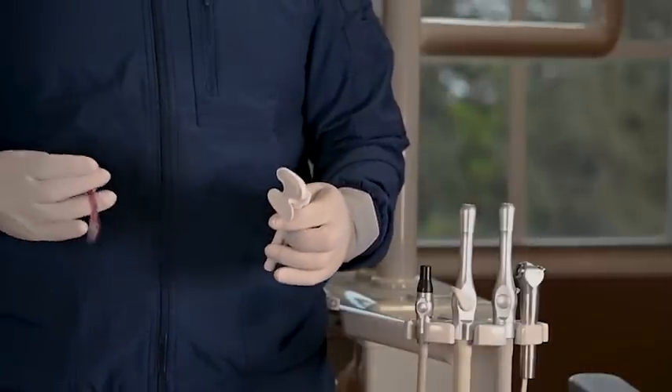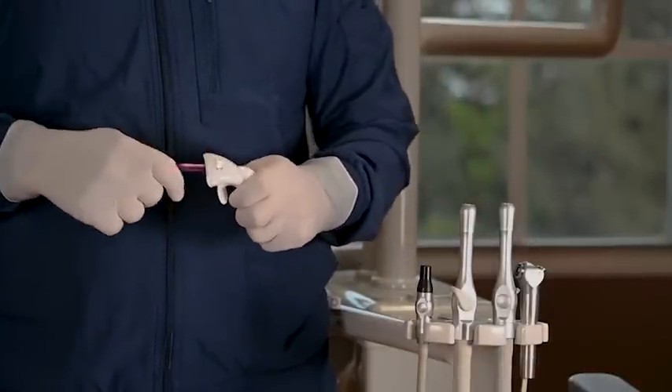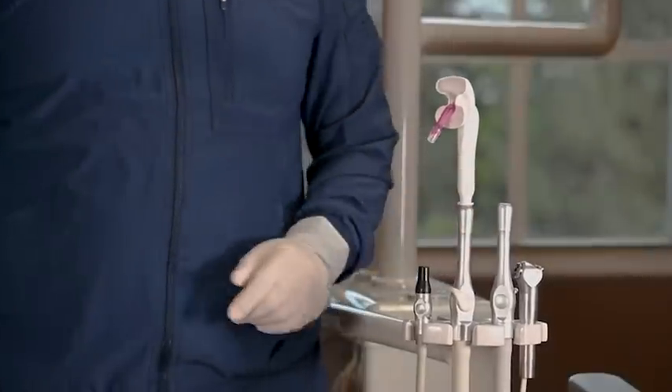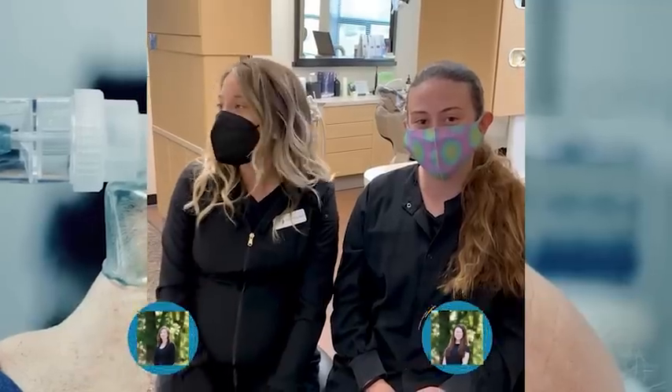The best part is you do not need any specialized equipment or hoses to get started. If you have an HVE and a disposable saliva ejector, you are ready to go. We have received a lot of positive feedback and are thrilled that many top dental professionals and schools see the value of our product.